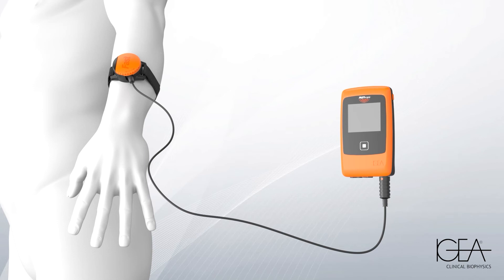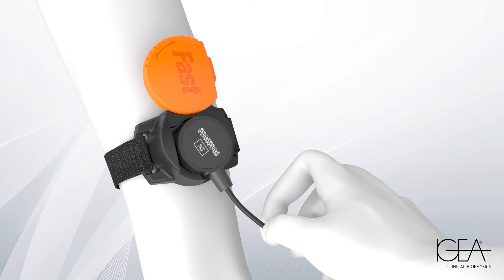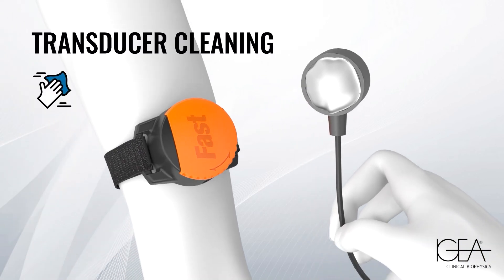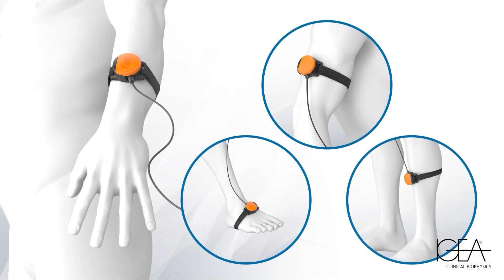At the end of the treatment, remove the transducer from the holder, clean the device and the treated area. It is possible to use Fast Therapy on both upper and lower limbs.